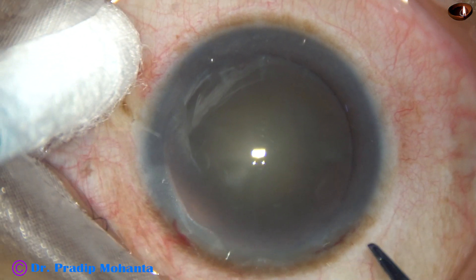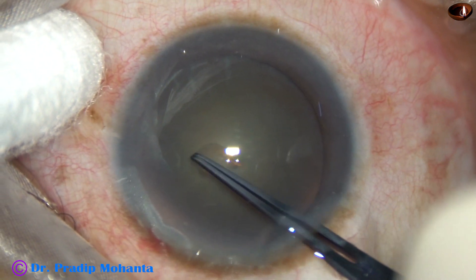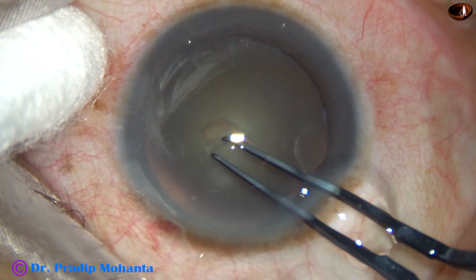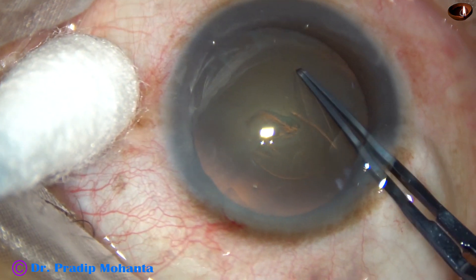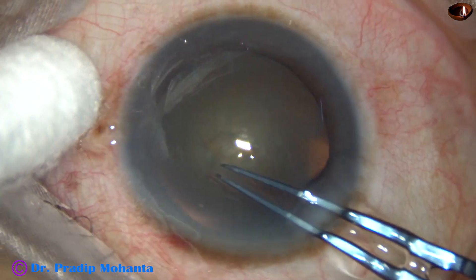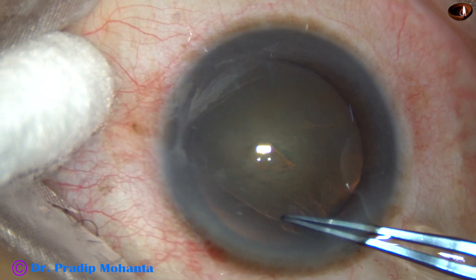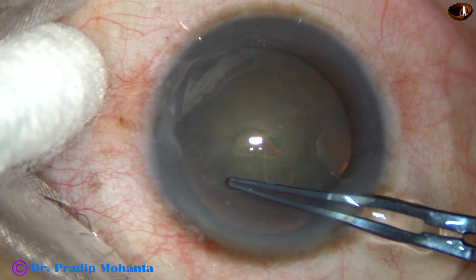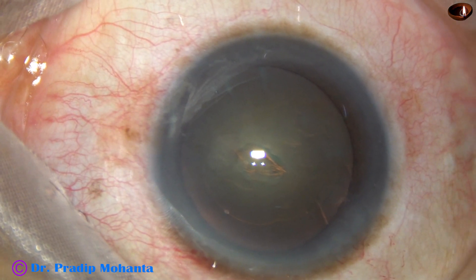In this case, I am going to use bimanual irrigation aspiration, so the side ports are of small size. Now, capsulorrhexis. The capsular tag has been raised by the utrata itself and by anti-clockwise movement, a continuous curvilinear capsulorrhexis of adequate size is performed.